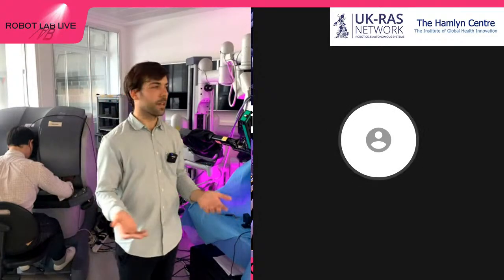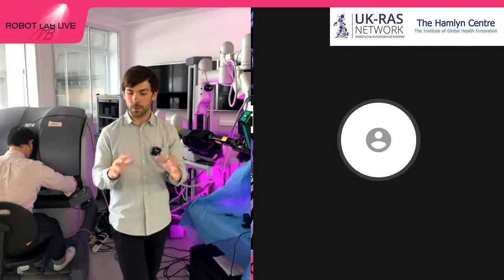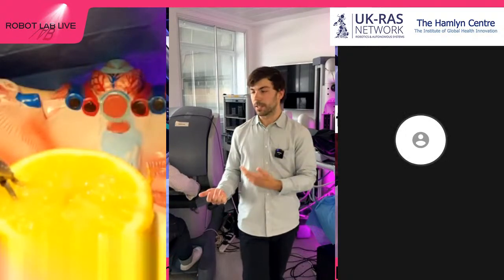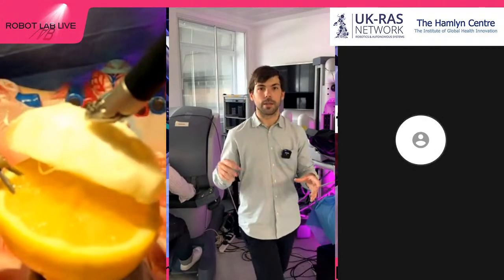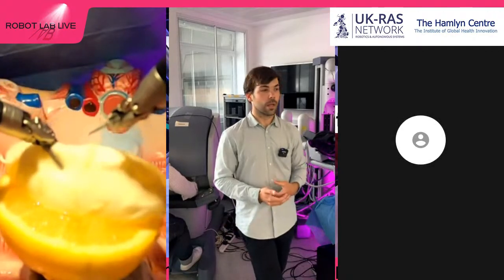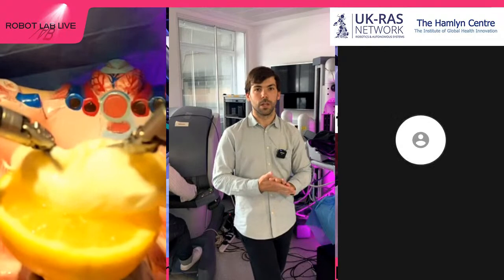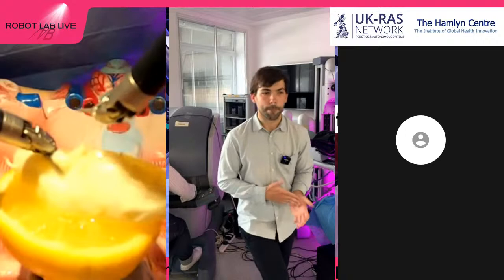And last, but probably the most obvious one, is that these tools are super stiff, right? And if you look at your hands, they are compliant and soft, right? So we have some researchers that are working on tools that can be added to this robotic system, and they can operate smoothly as a surgeon would. I think that's pretty much from our side. We now have a Q&A session, so if you have any questions or doubts, just feel free to ask them. Thank you.